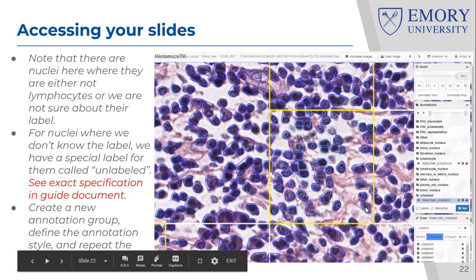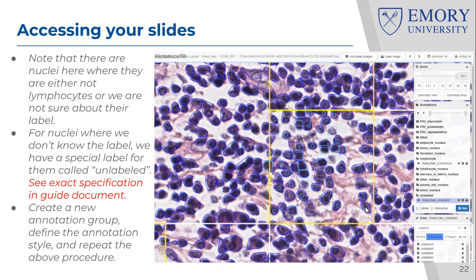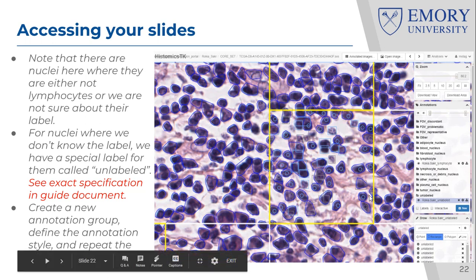Well, I place a dot. I place a dot because the boundary is correct. So I'm saying the dot. Whenever you place a dot, it means the boundary is correct. But the dot has a different color. The dot has the label unlabeled. So basically, I'm saying here that even though the boundary is correct, the label is not. Okay, and the label is unlabeled essentially.